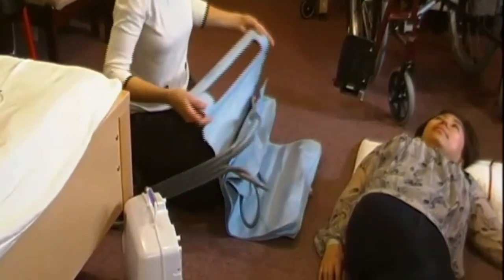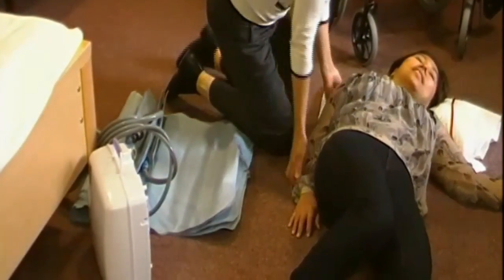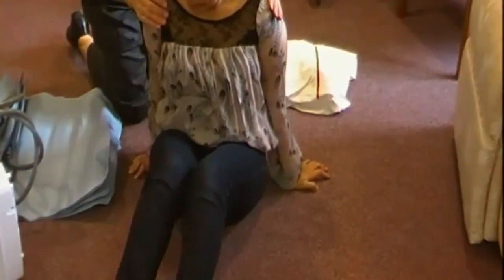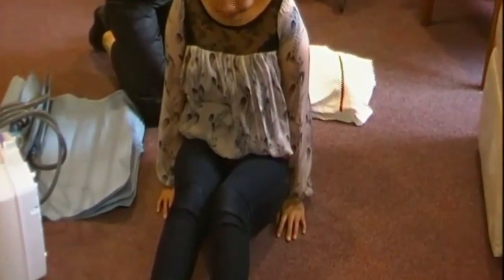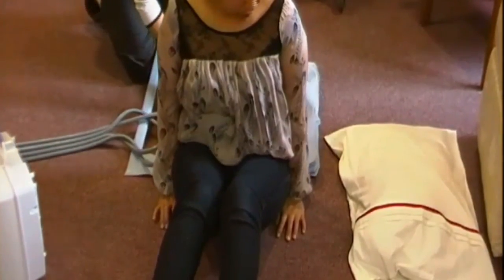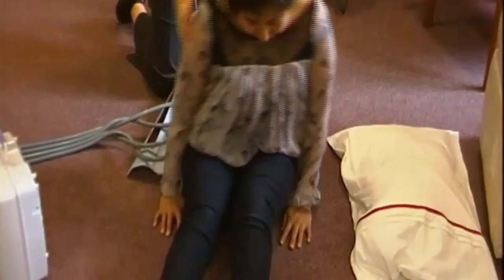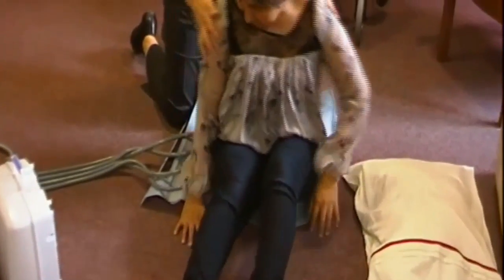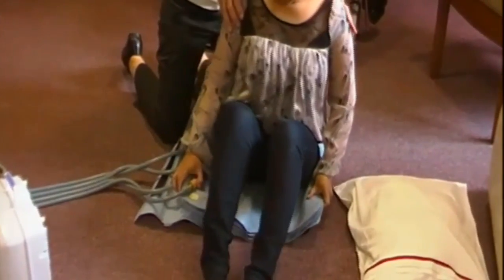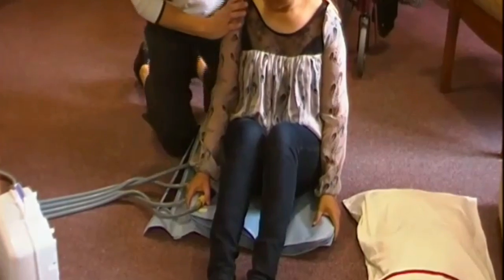Right, Grace, what we need to do now is to get you into a seated position. Are you able to sit yourself up? We have full instructions on how to put it under someone if they're not able to do this, but we're just demonstrating with Grace today. Simple, straightforward method. What we need to do, Grace, you need to shuffle yourself back onto the cushion. That's it. And you want to be well back on it, about 1.5 inches from the back. Because if we don't have you far enough back on it, when we blow it up, you'll be moving forward. Okay?